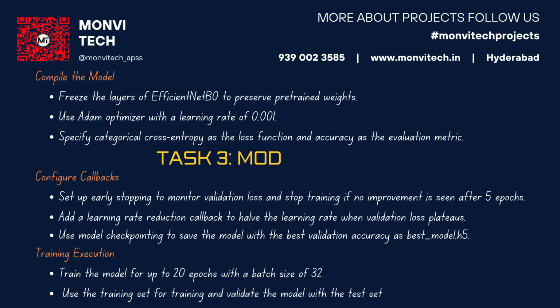Compile the model. 1. Freeze the layers of EfficientNetB0 to preserve pre-trained weights. 2. Use Adam optimizer with a learning rate of 0.001. 3. Specify categorical cross-entropy as the loss function and accuracy as the evaluation metric. Task 3. Model training configure.